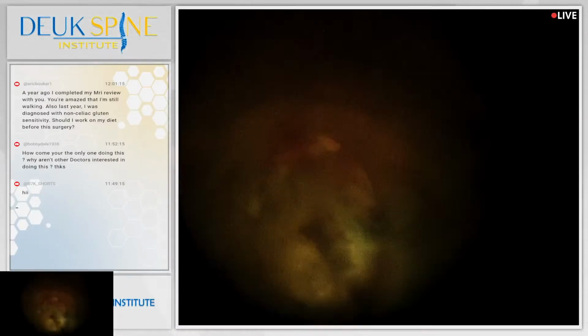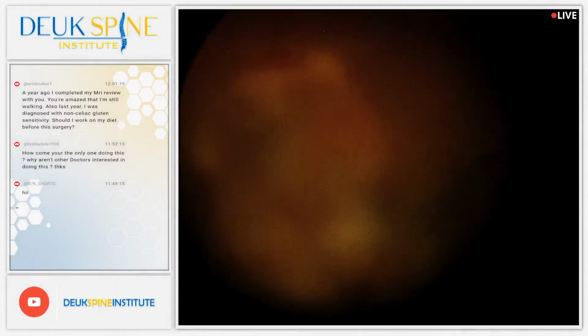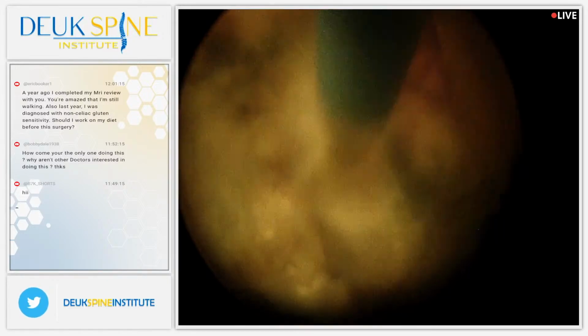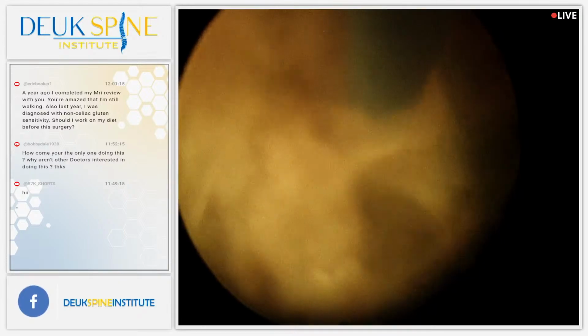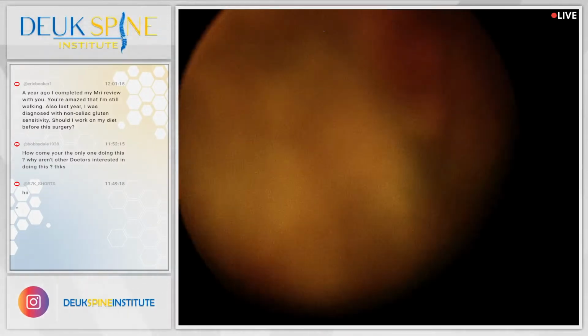Welcome back. You can see in our video that we use a laser to repair the disc, and that the disc is the most common cause of back pain, and that's what is causing this patient's pain. Okay, we're done with the herniation, and we're going to be waking our patient up in just a few minutes. I know we have some questions.